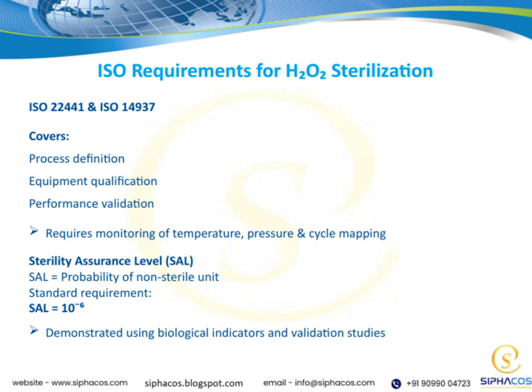out. They also specify equipment qualification, which means verifying that the sterilizers are capable of achieving the desired sterilization conditions consistently. Performance validation is another crucial element, confirming that the entire process actually works effectively over time. Monitoring plays a vital role here, and these standards require continuous oversight of temperature, pressure, and cycle mapping. This helps ensure that all conditions stay within the validated parameters, maintaining process integrity.